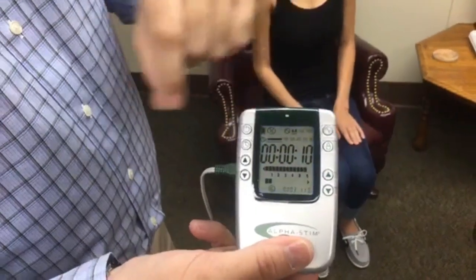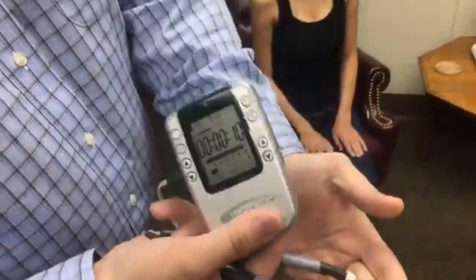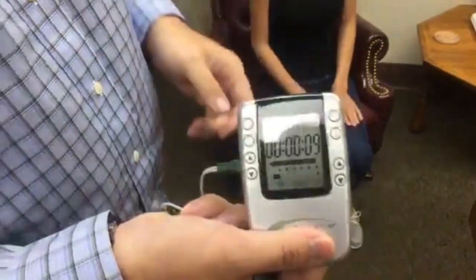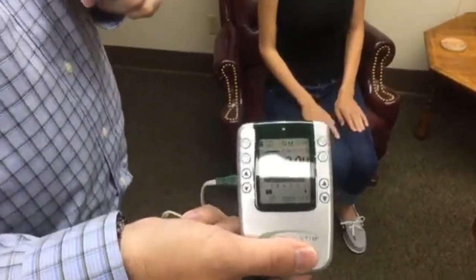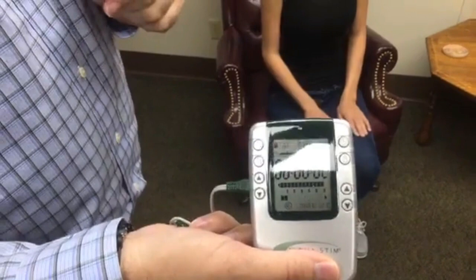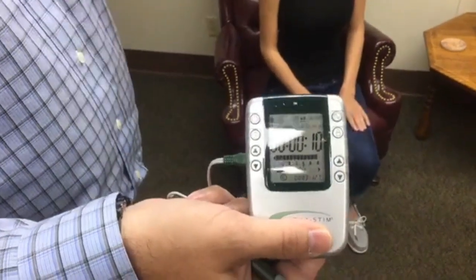We have our probe timer set to a 10-second timer. As soon as you touch the probes to the skin and connect the circuit, you'll hear it beep and it'll start to count down. That gives you 10 seconds. It'll beep again when it's finished — that's the indicator to move to the next location. Each place we put the probes is there for 10 seconds, then you move to the next spot.